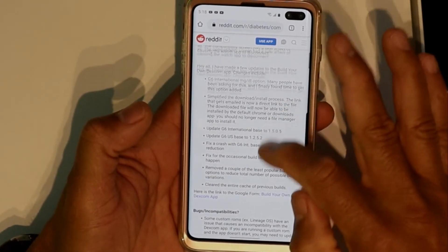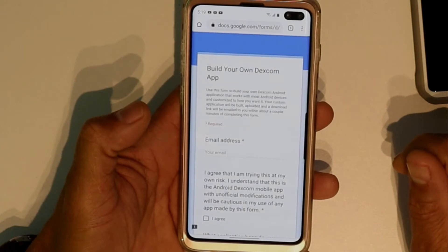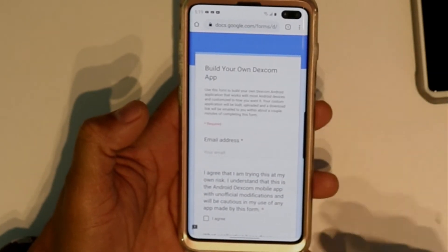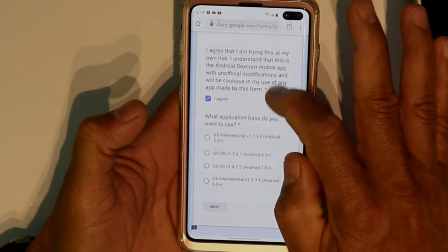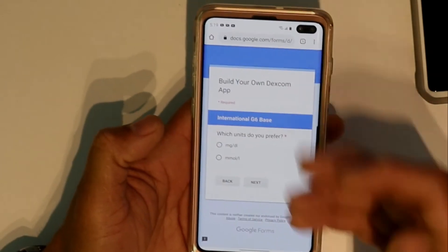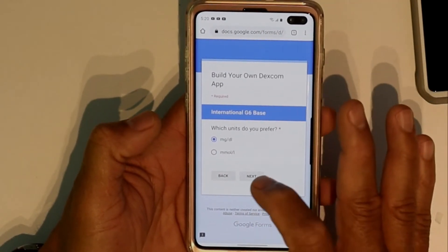Remember, you're doing this at your own risk. We're going to look for the updated version — "Build Your Own Dexcom App" — and click on that. I'll leave this link down below for you guys so you can just go click on it. You're going to put in your email address, click agree, and go with the G6 international version, then click next.